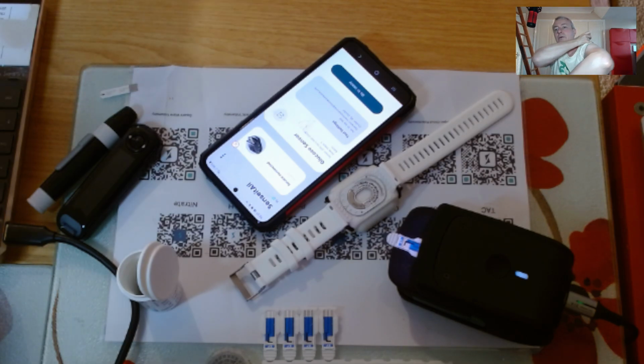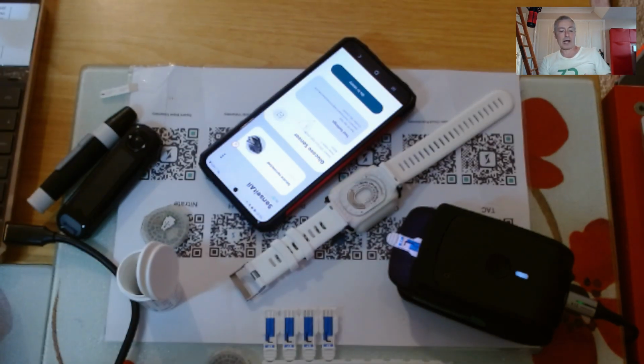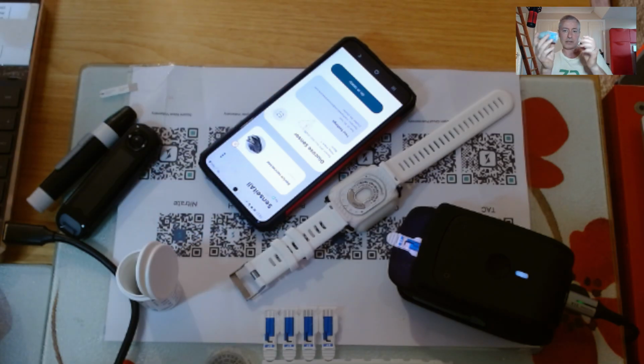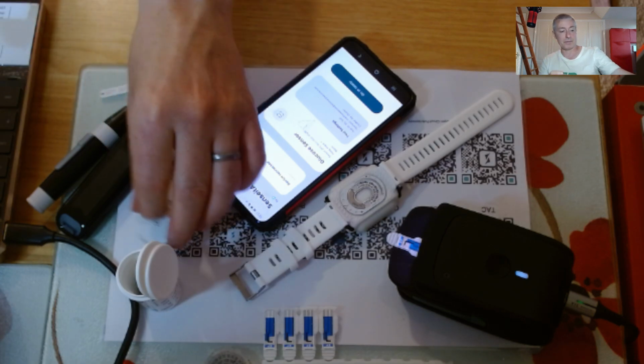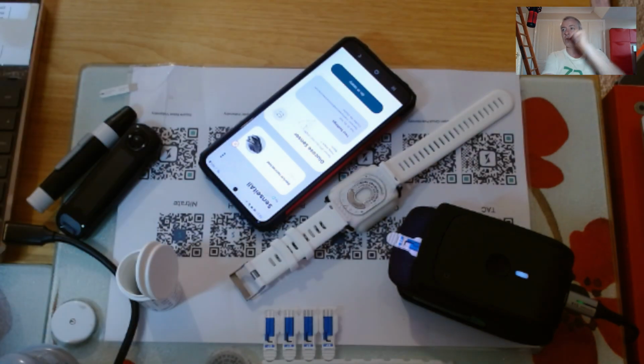When you see people walking around with these patches on their arms, often they are using the Abbott Freestyle Libre 2 or Abbott Freestyle Libre 3. I just saw Abbott saying the other day this has been, I don't know if it's the fastest selling medical device in history. One of the problems it's got is the size of this applicator. This applicator is quite big, so there's quite a lot of plastic in putting this device on the arm, but Abbott know what they're doing, so I'm sure that they've worked out the economics on this.